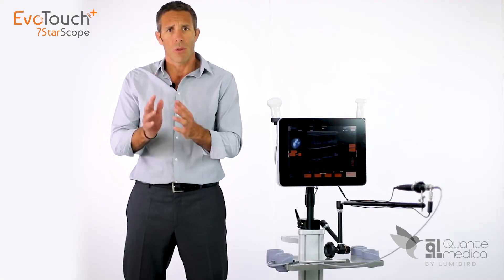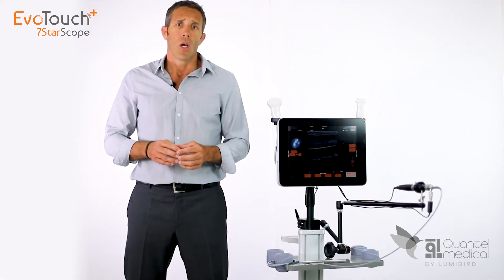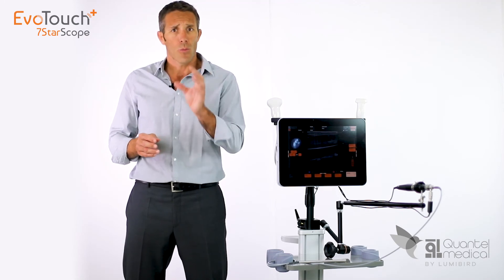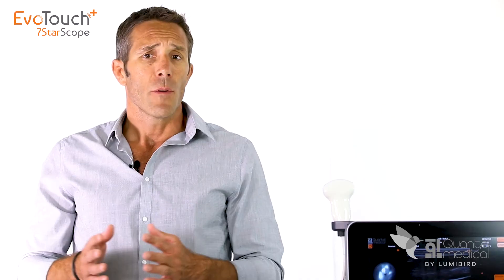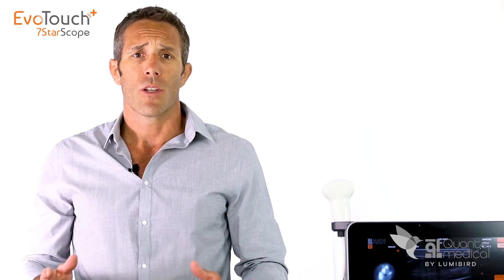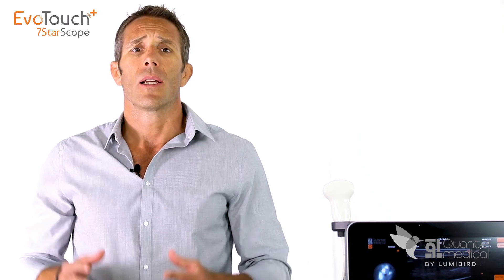The micro-invasive nature of percutaneous procedures allows doctors using the EvoTouch Plus 7StarScope to free themselves from the constraints of the operating theater. The EvoTouch Plus 7StarScope is a real game changer in the world of interventional ultrasound.